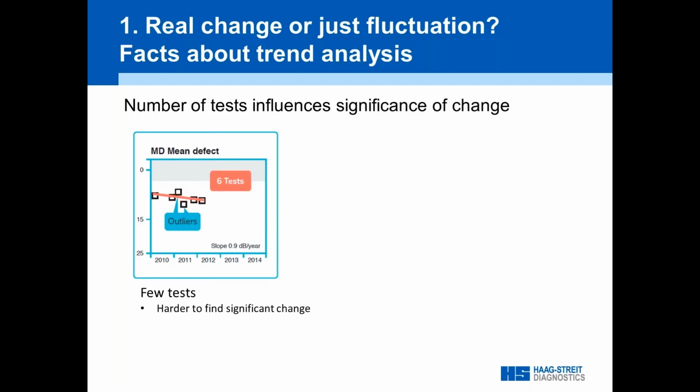Now, I'll just give you some examples on where to be cautious. The statistics are, as I showed you before in the graphics, a bit better than just human interpretation of a series of fields, but they're not perfect.